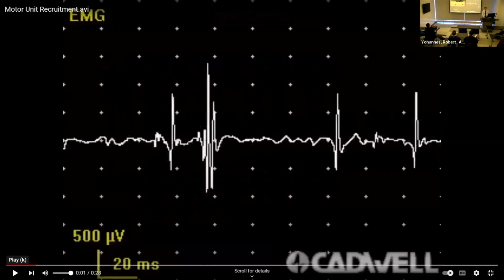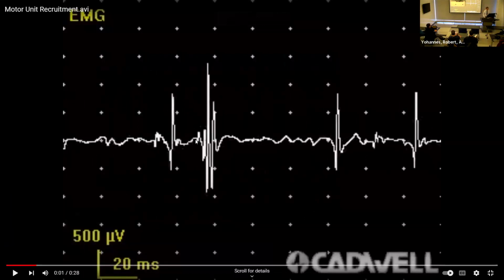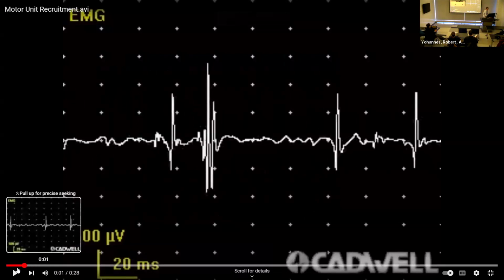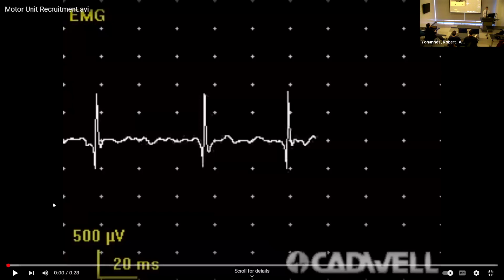Okay. So what you want to hear here is these are normal units. And then occasionally we'll see an increase in the force. You'll hear that the rhythm, that the rate is higher. And when the rate is higher, you'll see on the screen more shapes. So this one is one type, and here we have superimposed 2 other units, I think. We'll see in a moment. So listen for the sound and the increase in the rate, but also on the screen, you'll see more different appearing units. So here's one, and you'll see in a moment other appearing shapes.